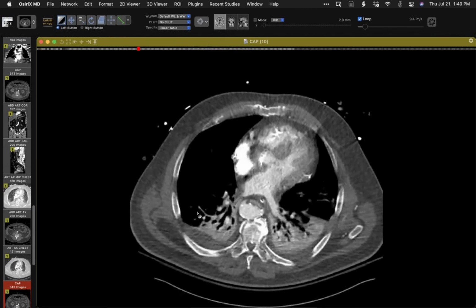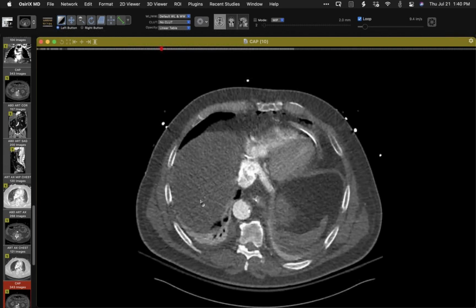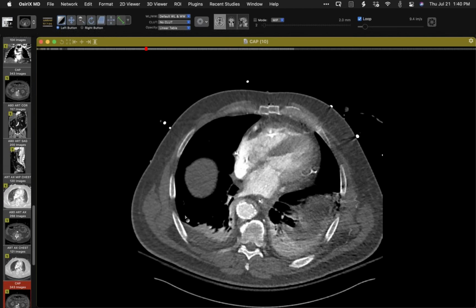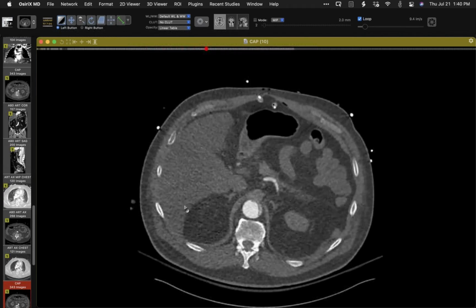You just don't have the strength in the wall. I don't think it's hard to tell what was intended with that, because there's not enough tissue strength to hold a stent. Well, false lumen definitely not intended, since that's resulting in the mesenteric ischemia.